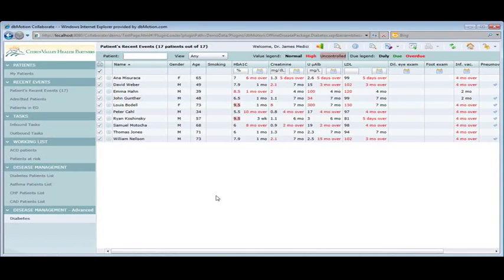I am sure that there are a lot of questions out there in terms of analytics and reporting, which I'll be glad to talk about. I will state that there is a lot of overlap right now within the Allscripts world, and where does this belong? I'll share with you my own belief is that the word analytics probably means a bigger thing. I think to be able to do reporting on population health clearly has some basis here, and if we can do that at the point of care, that'll be useful to physicians as well. So I'll be glad to talk about that if people have questions there as well.